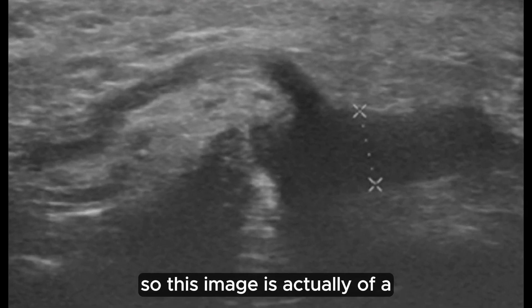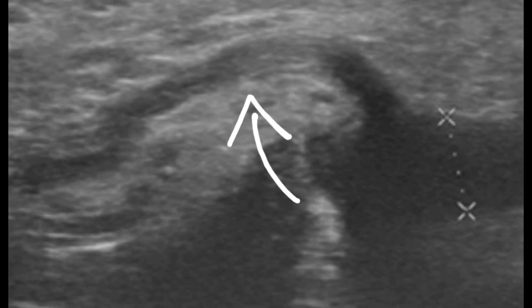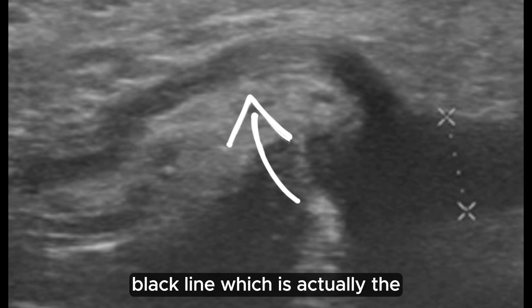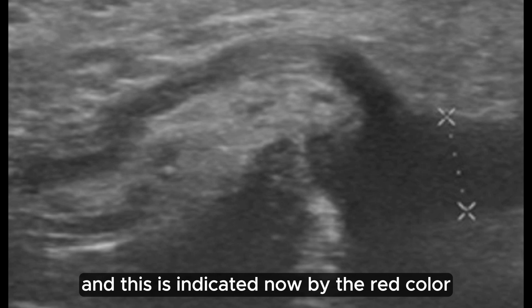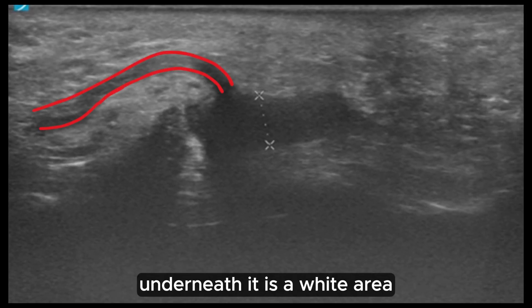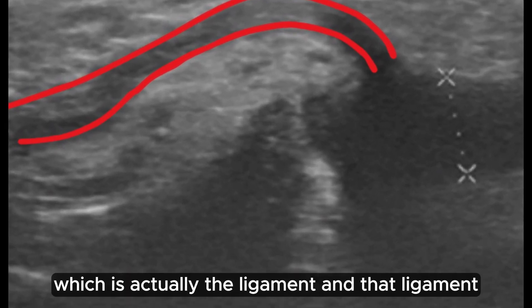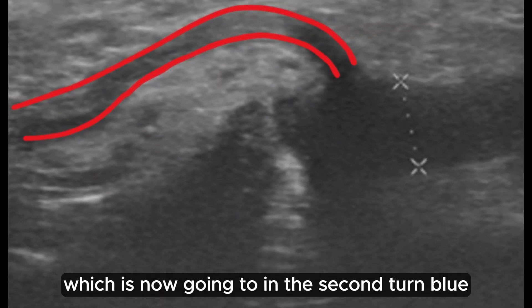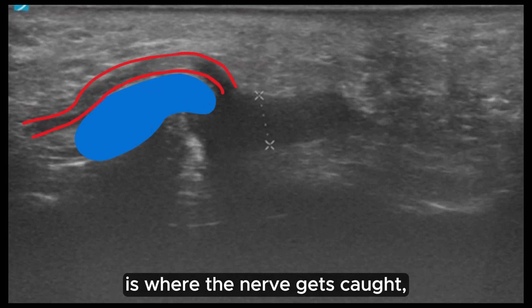This image is actually of a Morton's neuroma. The arrow is pointing towards a squiggly black line, which is actually the nerve where it's normal — and this is indicated by the red colour. Underneath it is a white area, which is actually the ligament. And that ligament, which is now going to turn blue, is where the nerve gets caught.